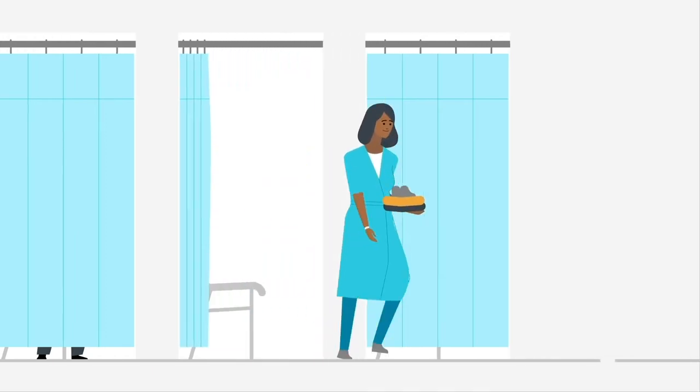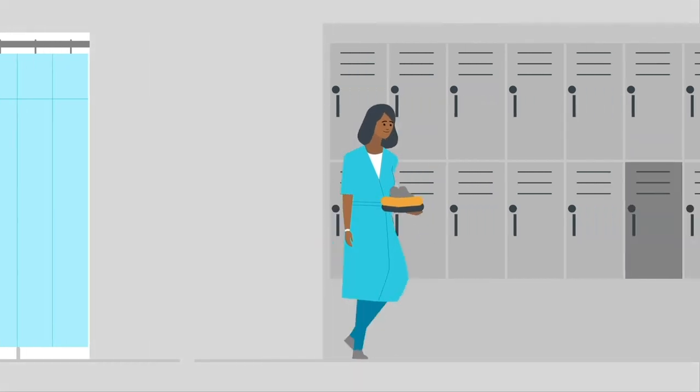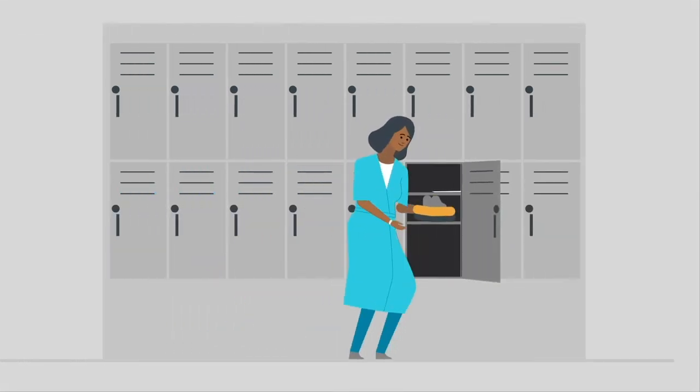No metal is allowed in the exam room. Lockers are available, but it's best to leave your valuables at home.